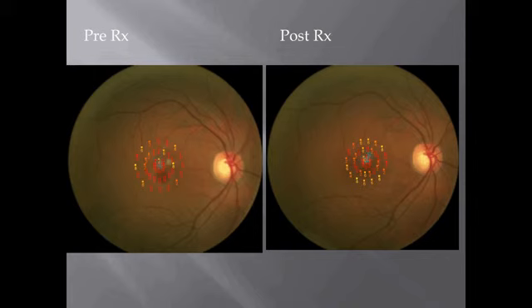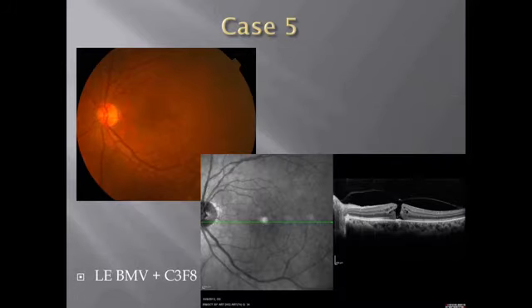And it also depends on, again, the history of the hole, how long it's been there, and that's why even the visual acuities are correlated based on how long the hole has been, what grading the hole has, and sometimes the patients don't recover much vision. So microperimetry is a good way to document exactly what's happening on every given point of the closed area of the hole that you see.